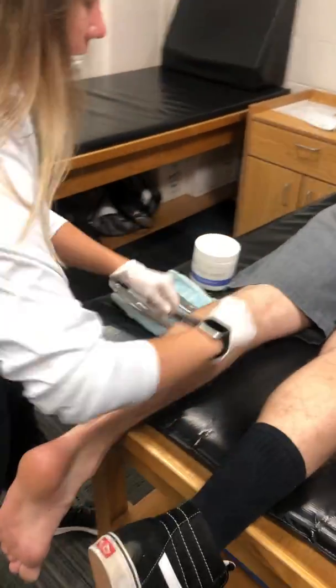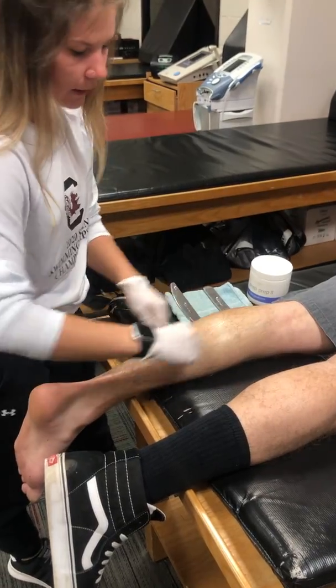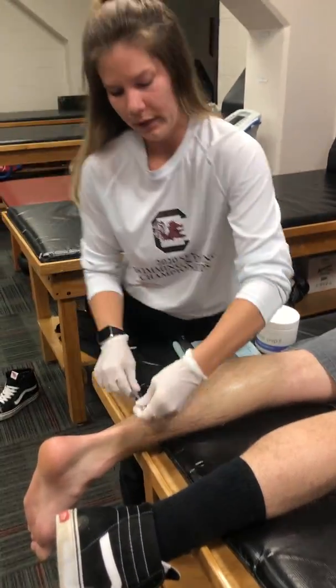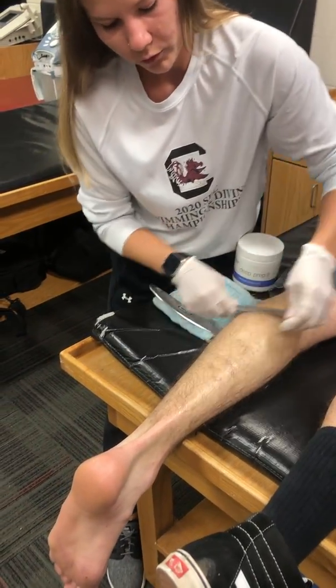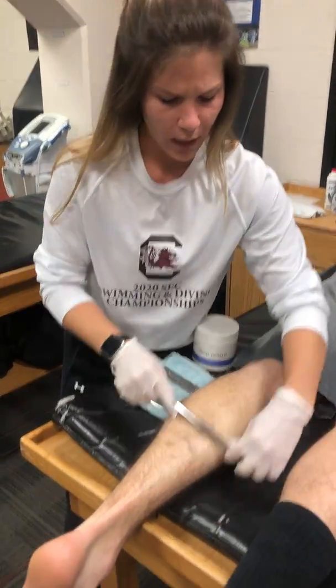I would also recommend flipping to the opposite direction, because you can feel different things from other angles and directions. For the angle of the tool, I would recommend 20 to 30 degrees.